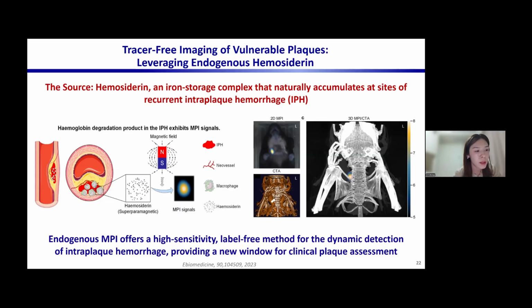This provides a completely new approach: label-free MPI imaging for plaques. Because it requires no injection, we believe this application has a much faster path towards clinical translation. Moving on, we plan to use handheld scanners to further advance this work in clinical settings.